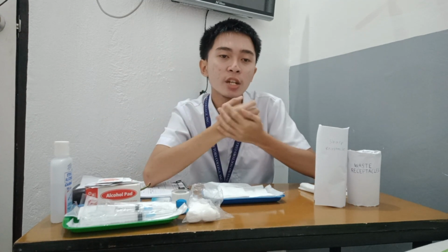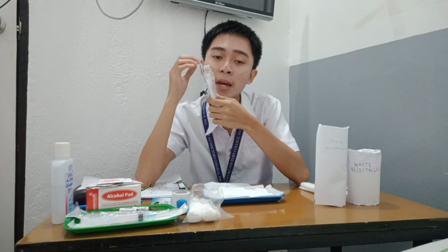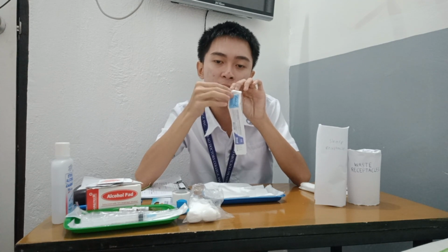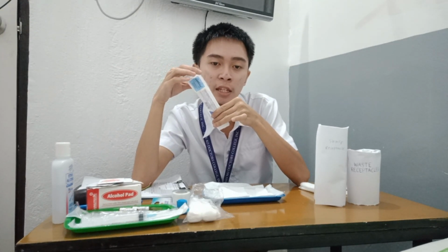Prepare the medication ampule for drug withdrawal, and I'm going to prepare my syringe. So I have here my 5cc, gauge 23 syringe for my intramuscular injections. I'm going to open the packet. Since my syringe comes with a needle, I'm going to loosen it first so that I can connect it to an aspirating needle.